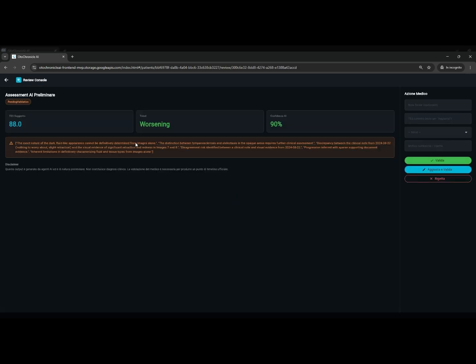Agent 3, the clinical validation and trust agent. It estimates how much we can trust the output, temporal coherence, historical AI-human agreement, confidence instability, and it recommends when a case needs prioritized human review.